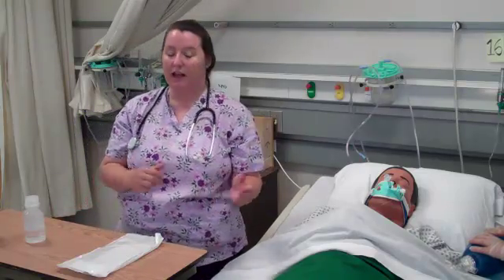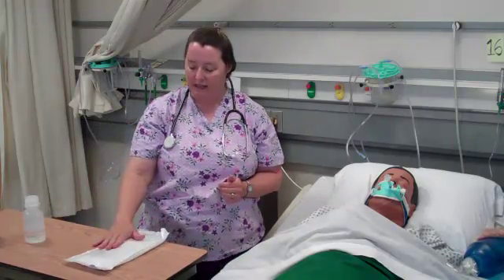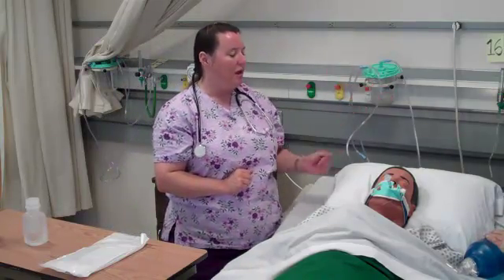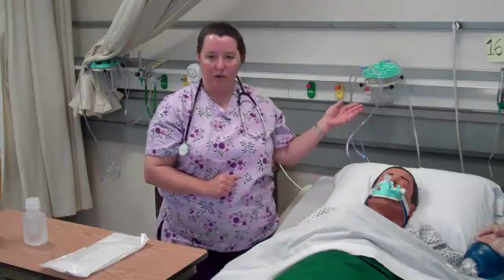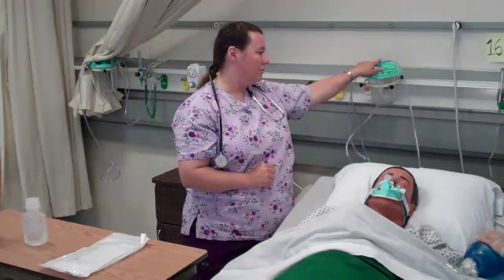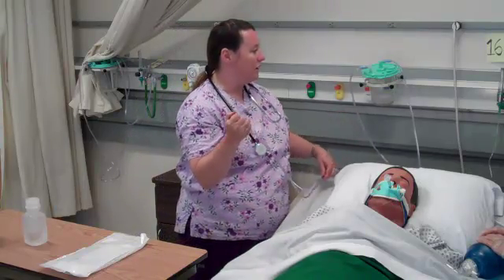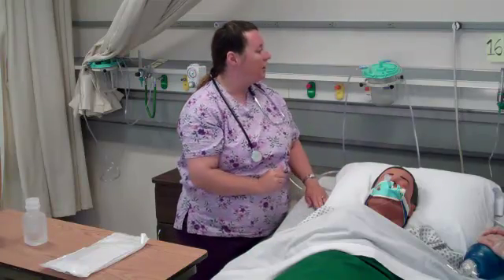I'm going to gather the equipment I need. I need my suction catheter kit and a container for my saline — I have sterile saline available. This is a sterile procedure. I also want to make sure I have an oxygen source available, as the patient is on a ventilator and we need to give supplemental oxygen between suctioning passes. I need to confirm my vacuum source is working and that pressure does not go above 120 millimeters of mercury.